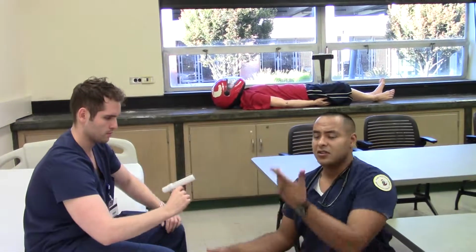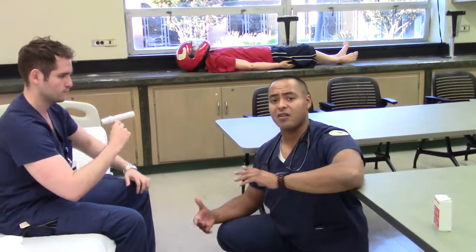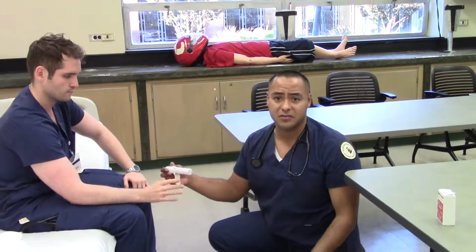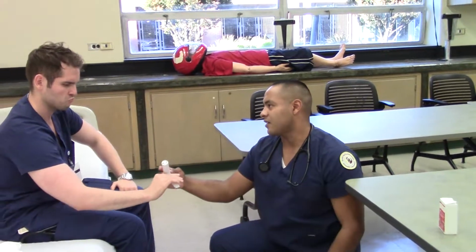Go ahead. So he does this 3 times. If you think the patient isn't giving full effort, have him do it again, because you want accurate numbers, so it's accurate, right? Okay, then he does it again. Oh, sorry, I did it.